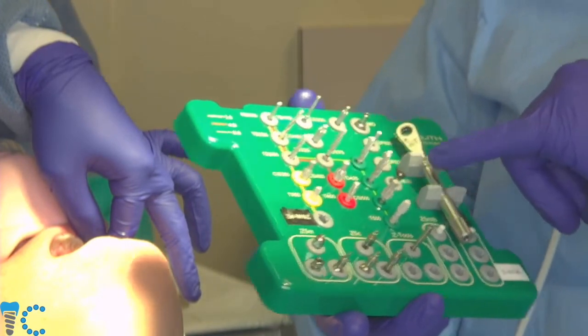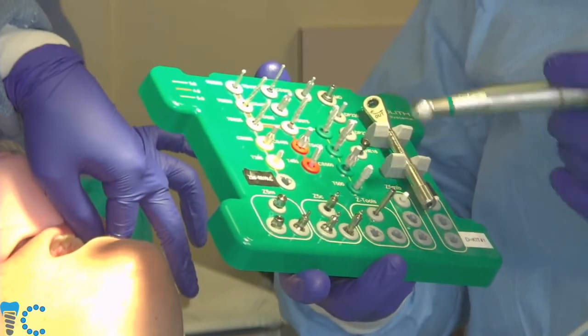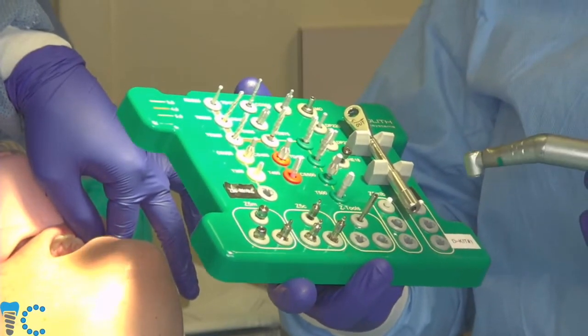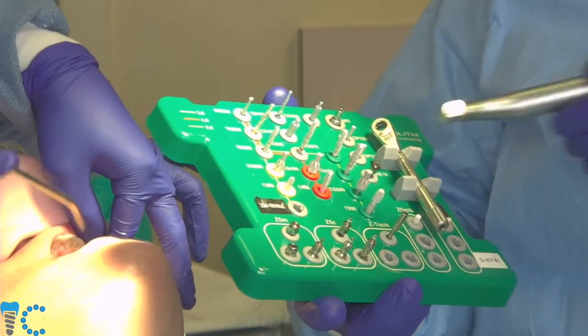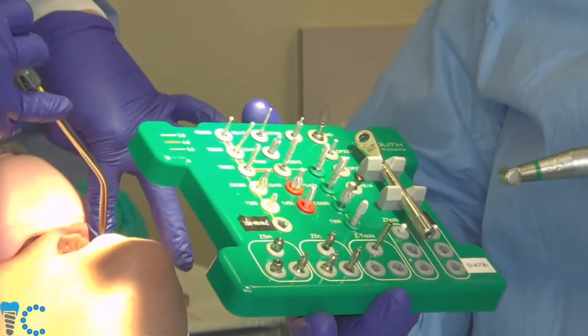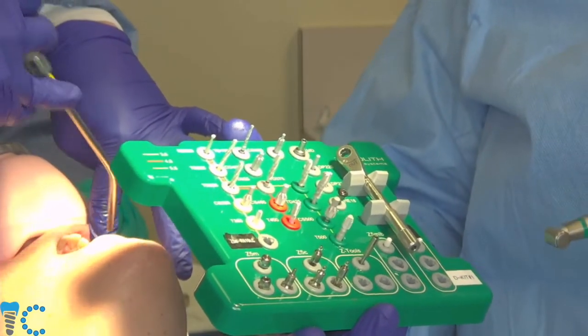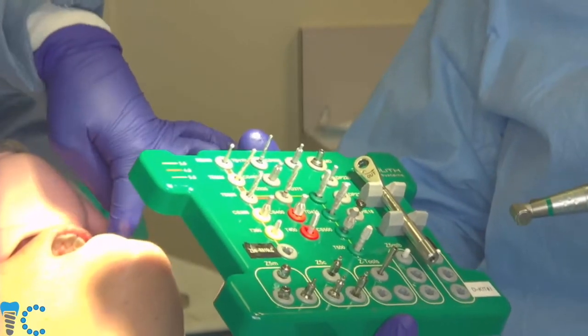Also for the tap, we have this instrument right here, and this is the adapter that we'll place into our handpiece that allows us to use the tap. So the tap goes into this adapter, and it's a pretty long assembly, truthfully, but you'll see, we'll be able to tap this with no problem.